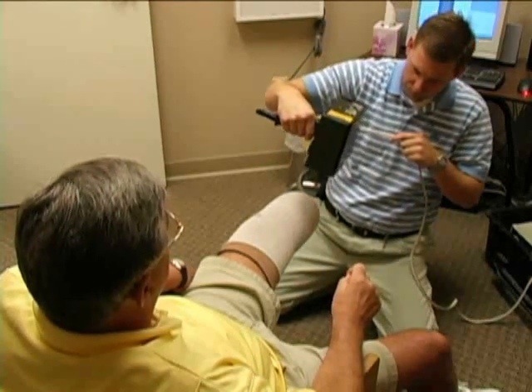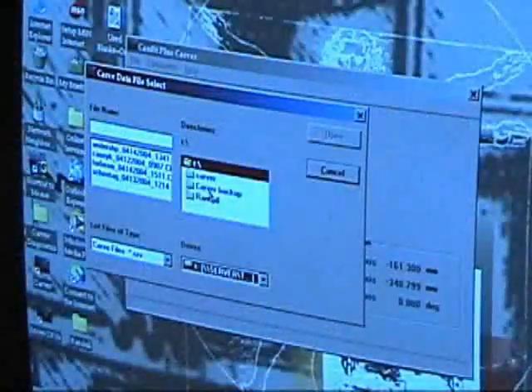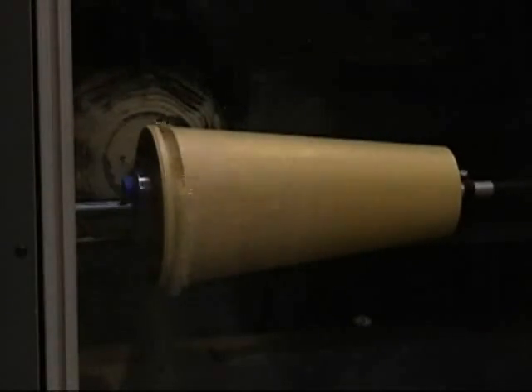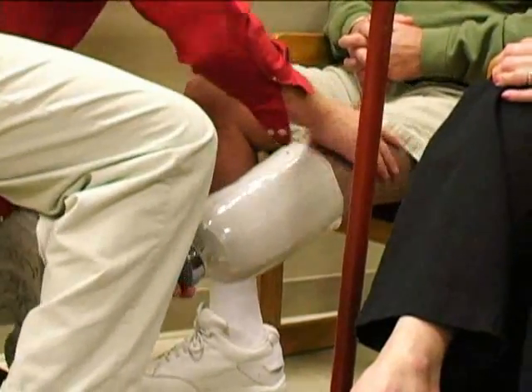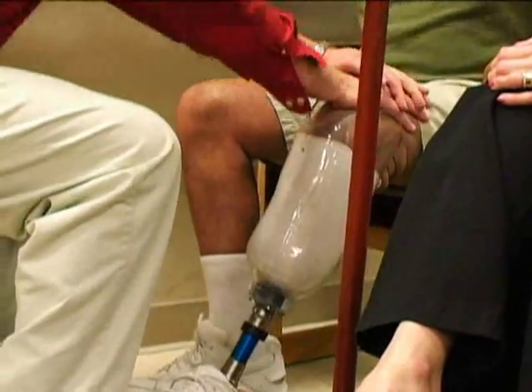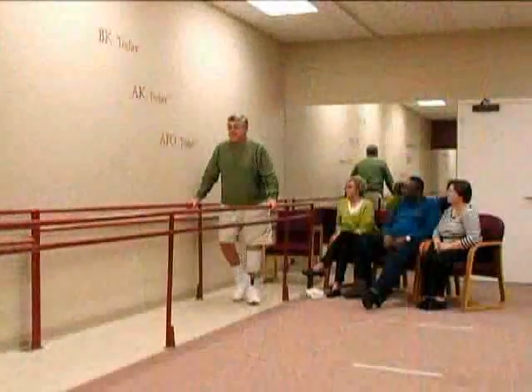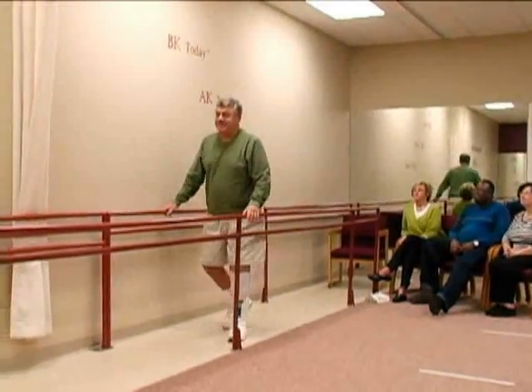We sit down with them and explain everything as we go. But while we're explaining things, we've already taken our scanner and done a scan, modified that socket, and sent it back. Our carver machine has received the information and carved out a model of that person — while we're still sitting there talking, explaining things, answering questions. Usually in about an hour and a half, we've got that patient in the gait room, walking them on that product and letting them see the comfort level. We spend a lot of time on our sockets — we want to make sure they're comfortable, functional, and going to do the job they need to.